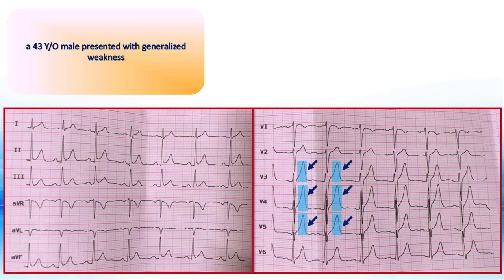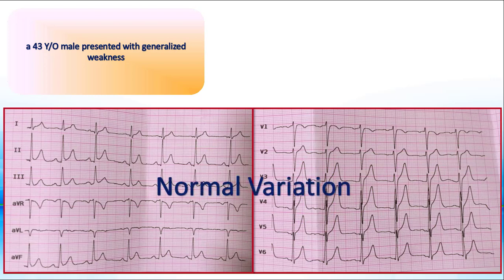Tall T waves are present in precordial leads. Here the upstroke is slower than the downstroke, therefore T waves are asymmetrical. They aren't peaked and no particular ST elevation or reciprocal changes are present, so normal variation is more probable in this case. Never forget that EKG findings aren't 100% sensitive and specific — therefore we must consider both acute ischemia and hyperkalemia as possible causes of weakness in this patient.